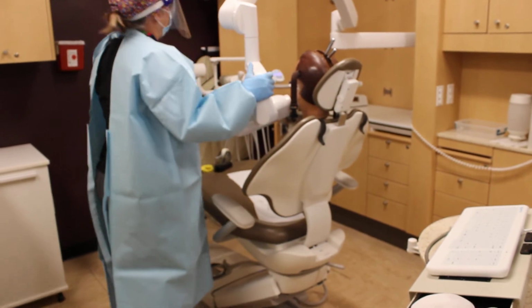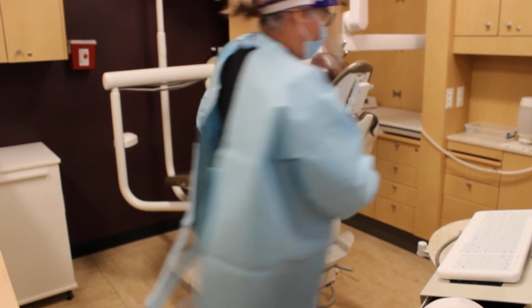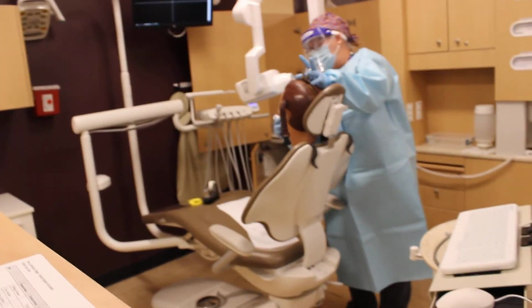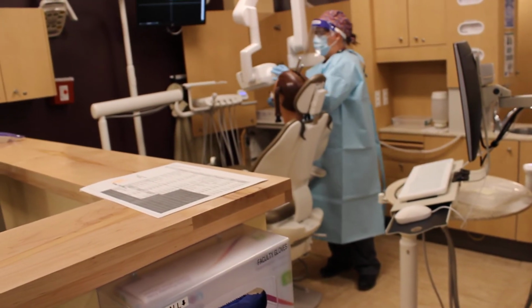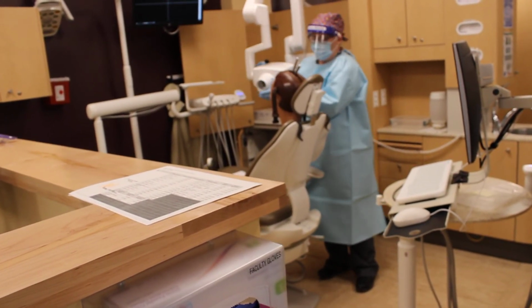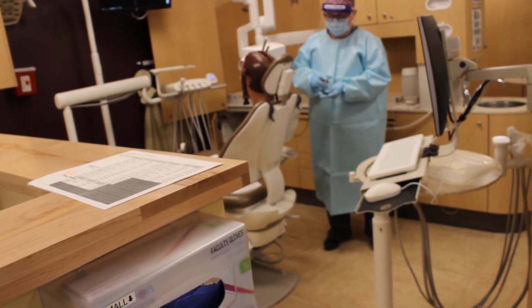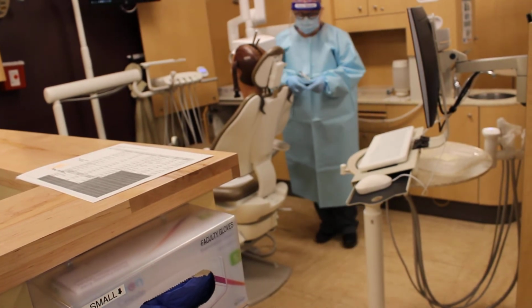So now we're going to the upper right. So with this system, you don't use the landmarks. You use your PID as your guide. So I'm going to set them up, put this in there, and then I'll show you what I'm talking about.